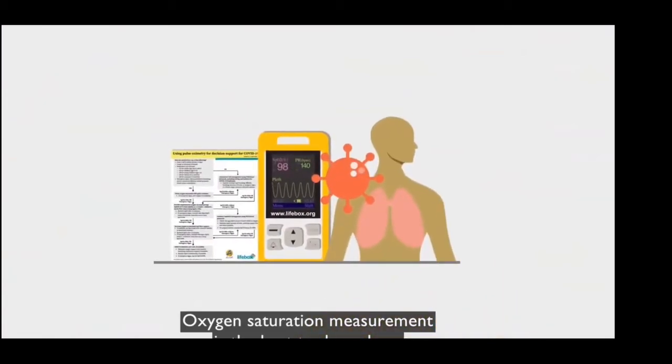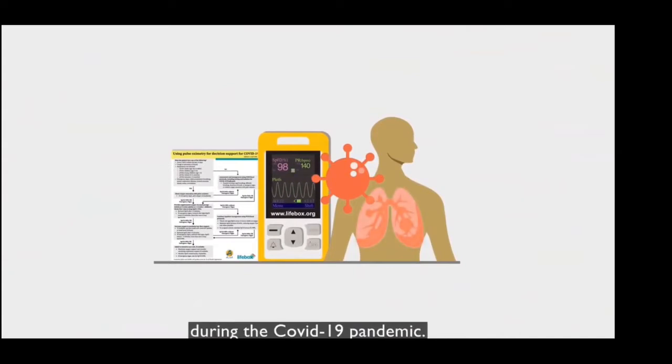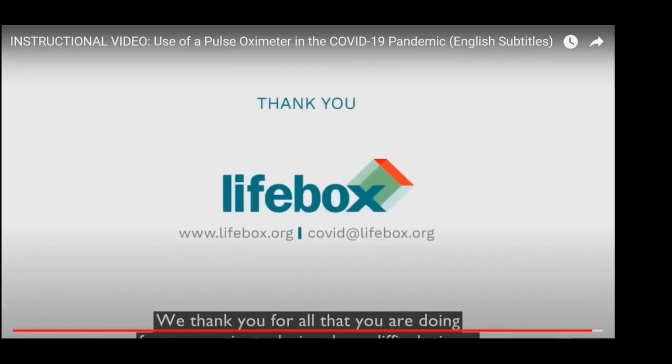Oxygen saturation measurement is the best tool you have to decide when to use and maximize precious oxygen resources during the COVID-19 pandemic. We thank you for all that you are doing for your patients during these difficult times.